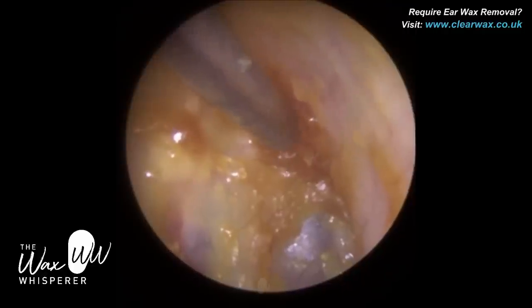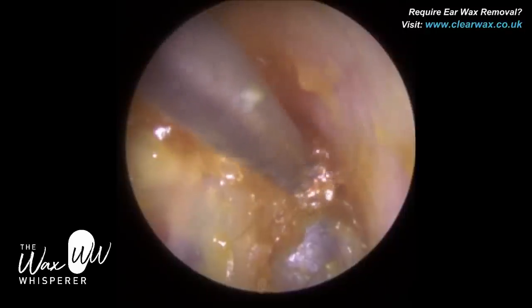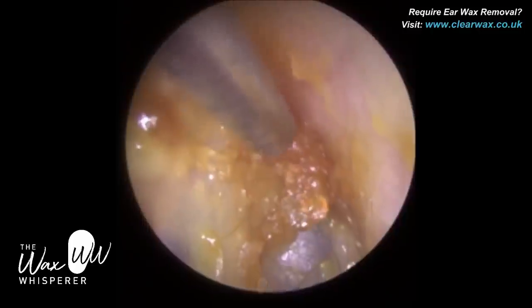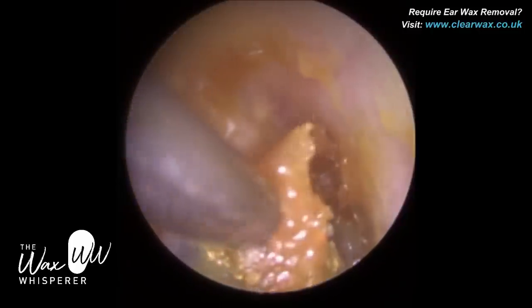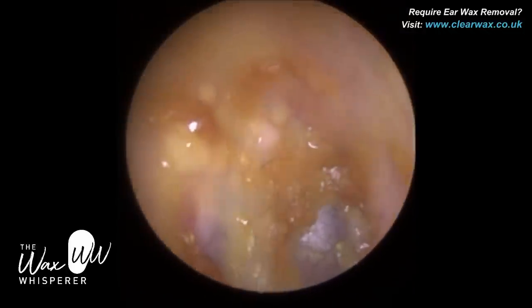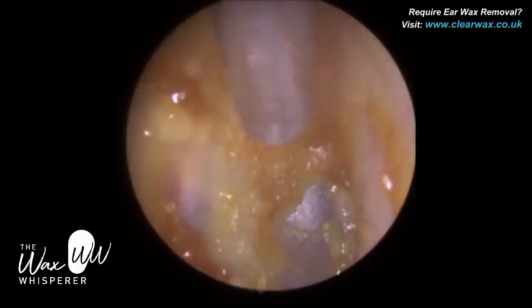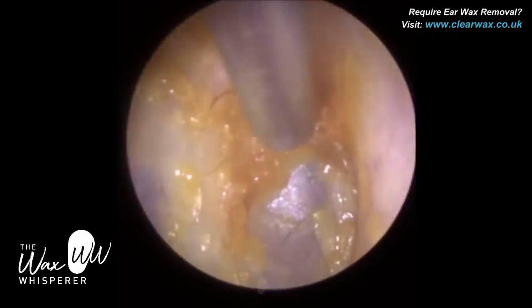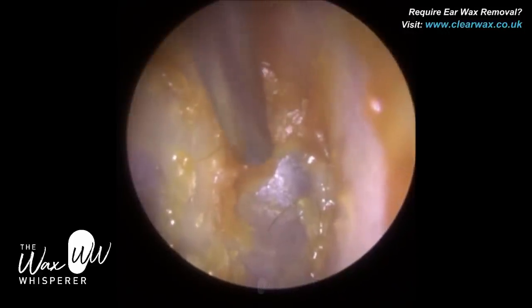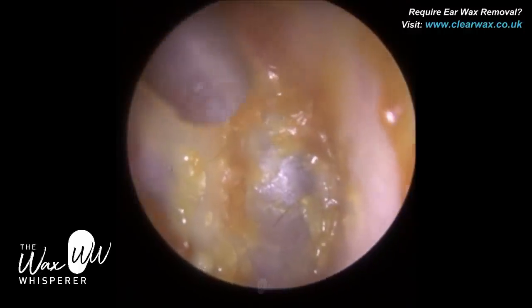Superiorly — another name for the top part of the eardrum is called the pars flaccida. The eardrum is only 0.1 millimetres in thickness — it's very thin, wafer thin. We've got to be careful, so you need a steady hand and obviously good optics. You need to be able to visualise the eardrum and also have good depth perception. There's just a bit of dead keratin wax impacted on the eardrum — just delicately kissing the surface of the eardrum to extract some of this wax.